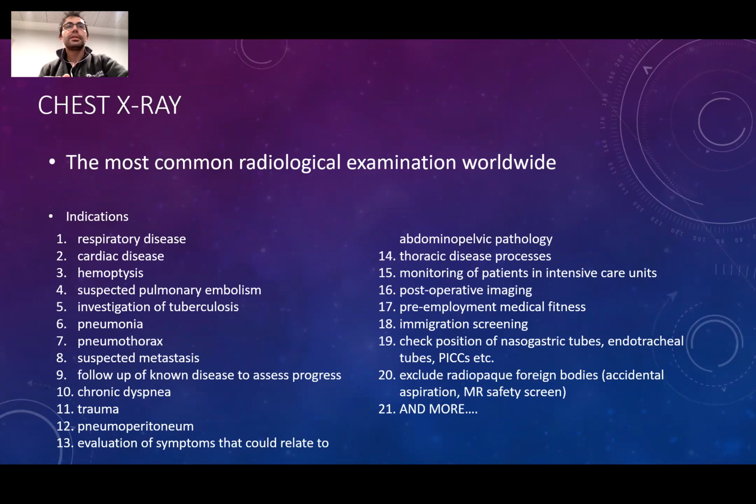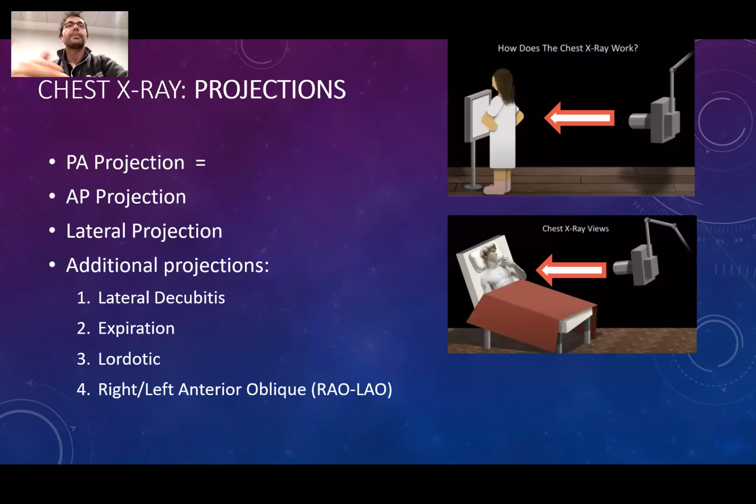Chest X-ray is the most common radiological examination worldwide. The indications of it are numerous. It doesn't end. There's 20 indications here, but it is not the end. It will be very commonly performed in your practice in the future. Like you will be seeing a lot of them.